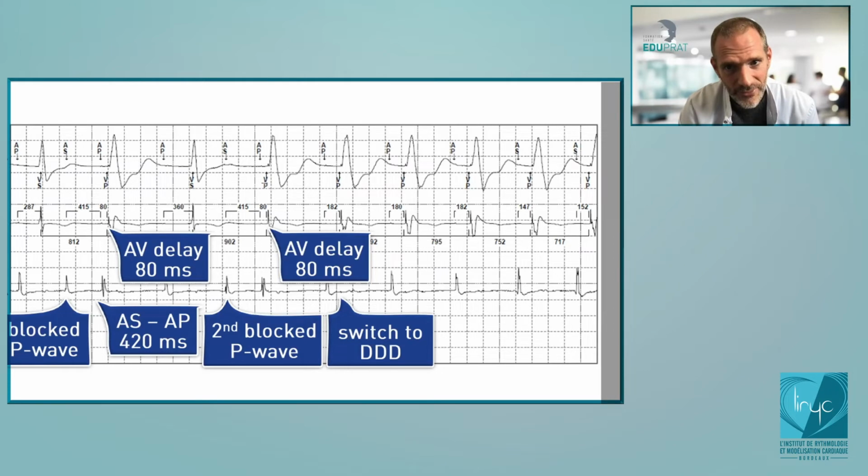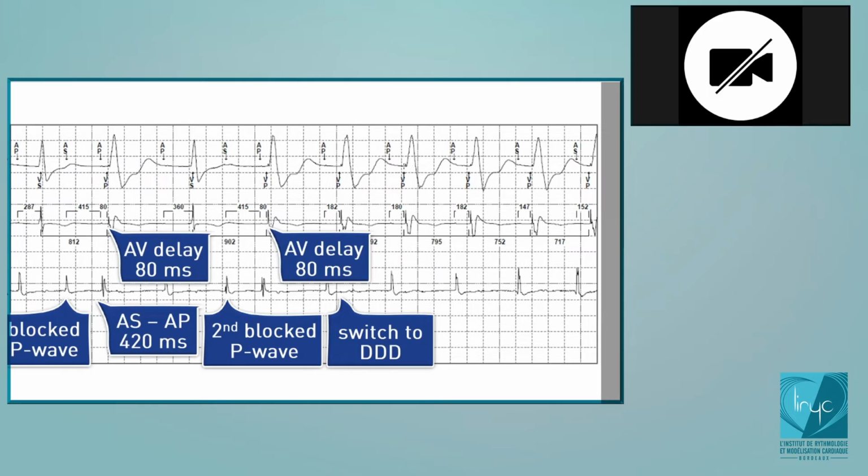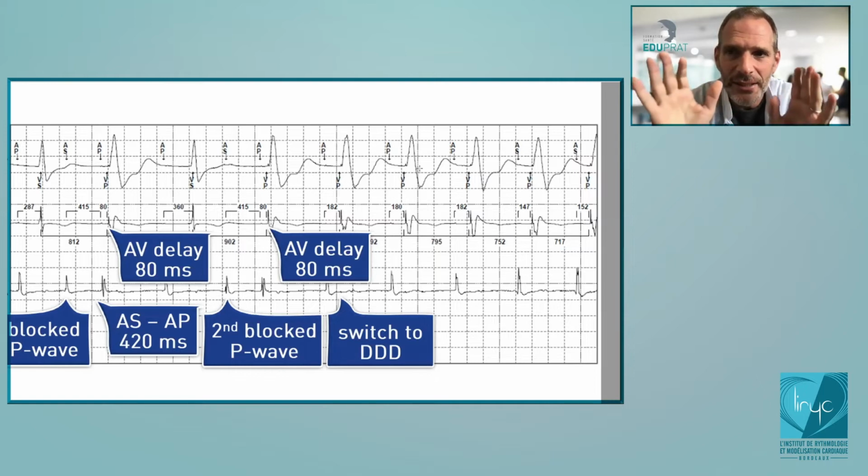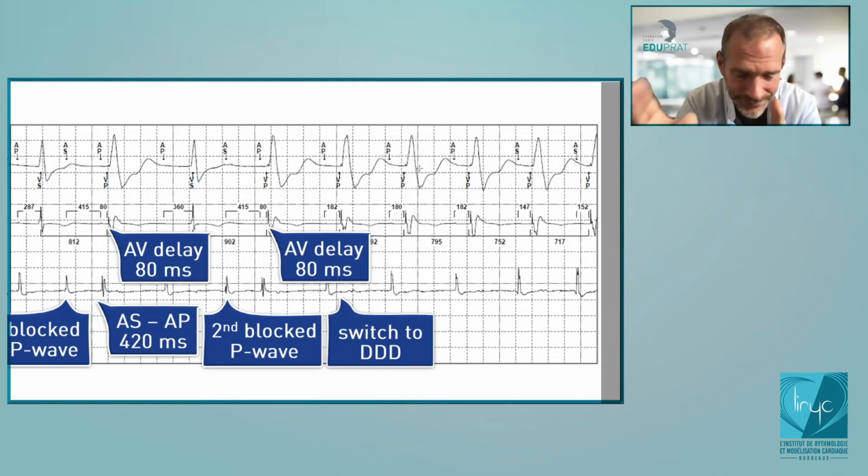But how do we set the exact interval? You don't set it. The values are 420 milliseconds minimum and 600 milliseconds maximum. But the device will measure the PR interval on every beat and average it to know when the window of analysis will end.